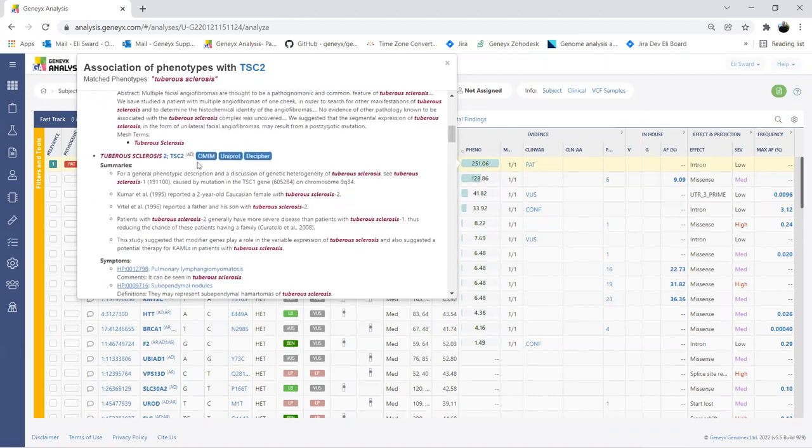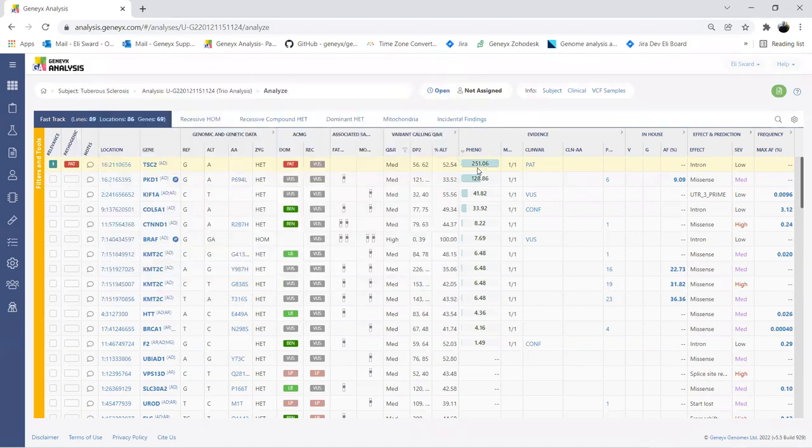In this example, we have information being pulled in from OMIM, UniProt, and DECIPHER, highlighting those key search terms, but also providing a hyperlink so you can investigate these in more detail. This would be for a clinical geneticist or clinical expert who wants to deep dive into the relevant information; really, we're providing you with a consolidated view of all of the information available. But as mentioned, this is all being integrated into a phenotype output score, and so you can strictly use this.